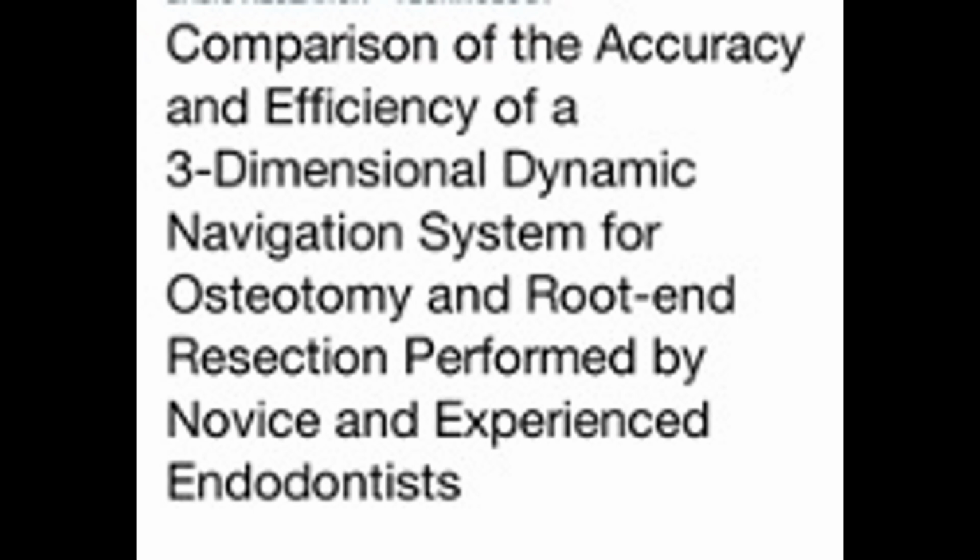Osteotomy and root end resection are two critical steps in endodontic microsurgery, and they can be time consuming, especially in areas with thick cortical bone, an area of difficult access, and also in areas with the risk to damage the nearby anatomical structures. The 3D Dynamic Navigation System showed the potential to reduce surgical time.